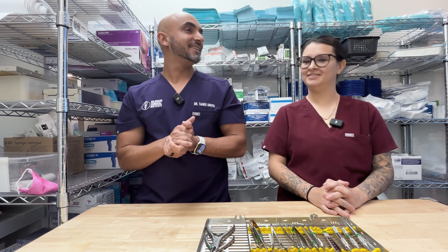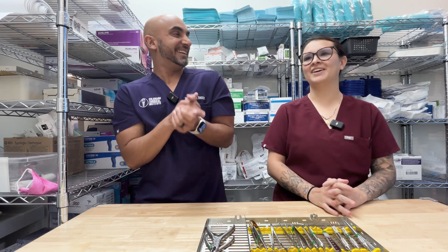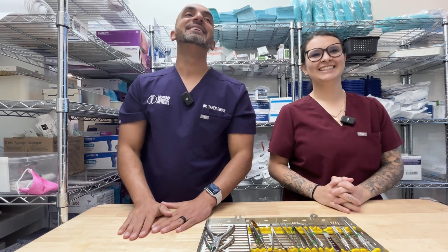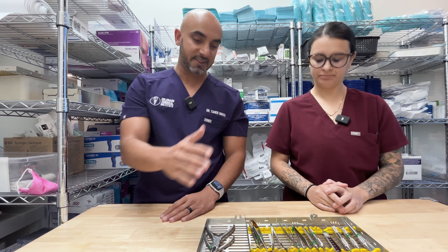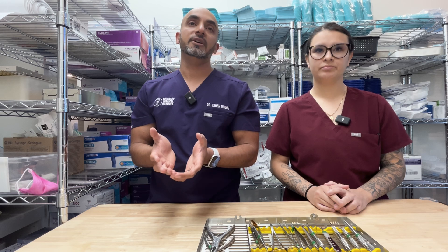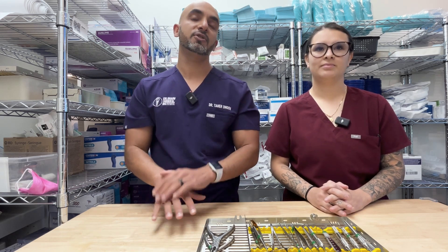Hey everybody, this is Dr. Doon from Colorado Surgical Institute and today I have the lovely Makayla here. She's been with me for seven years — seven best years of your life. So today we're going to be going over our surgical kits. This is what we use every single day in surgery. The reason we're doing this video is twofold: for educational purposes for everyone out there, and for the Colorado Surgical Institute courses, so you can watch ahead of time and have the knowledge on what you'll be using in the surgeries.